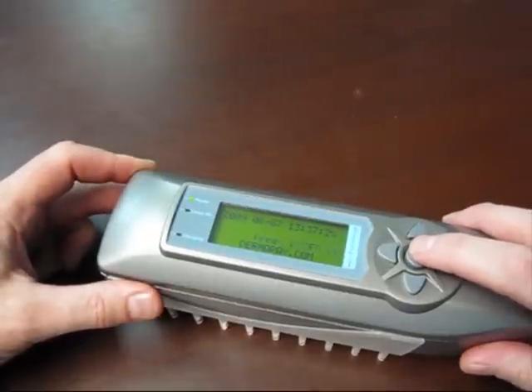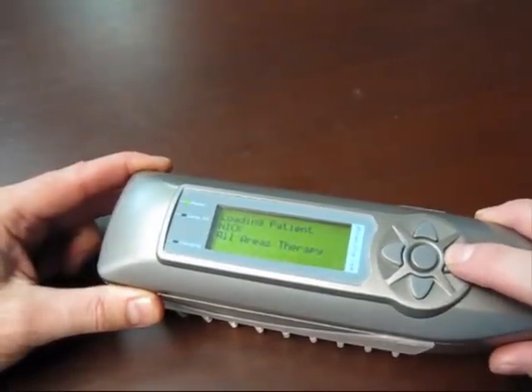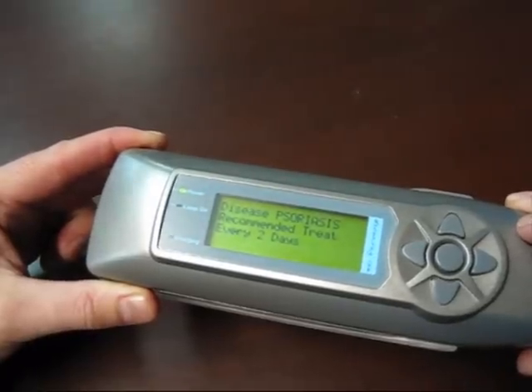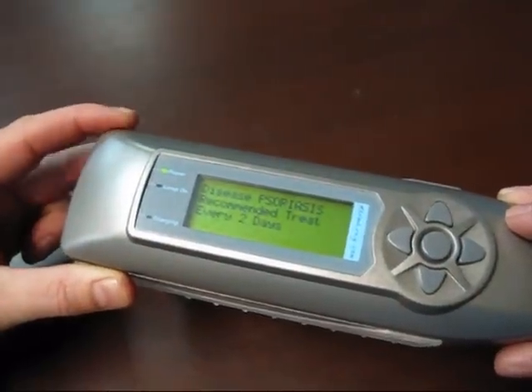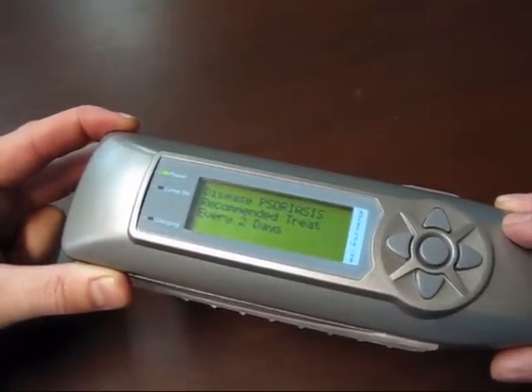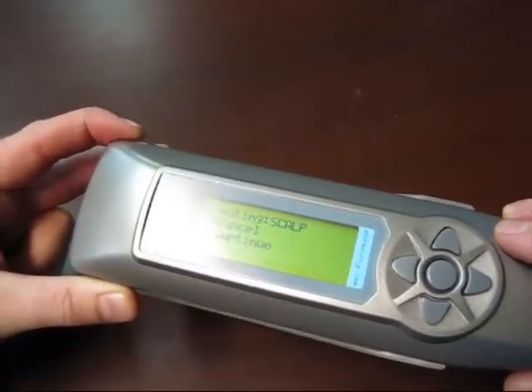If we wanted to load the next treatment for the last patient, being Nick, we can simply hold the right key for 3 seconds. Nick, all treatment areas, and you'll notice that it says recommended treatment every 2 days for psoriasis. So Dermaray has realised that I've already been treated today and I should wait another day before I run my second treatment. If I do want to override that, I can cancel or continue.